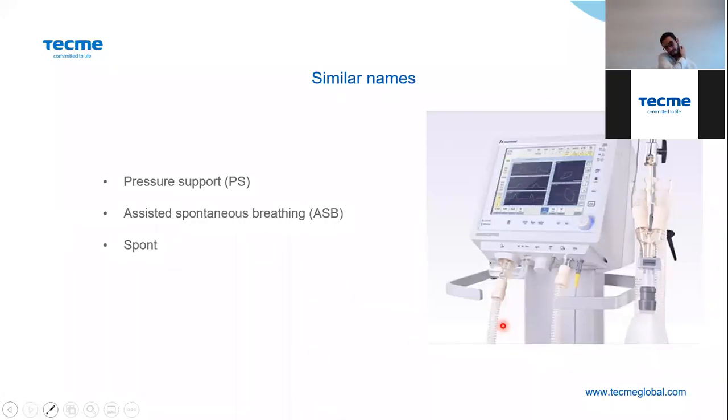Similar names: pressure support, assist spontaneous breathing, or SPONT, okay? Again, other brands have other names for the same ventilatory mode.